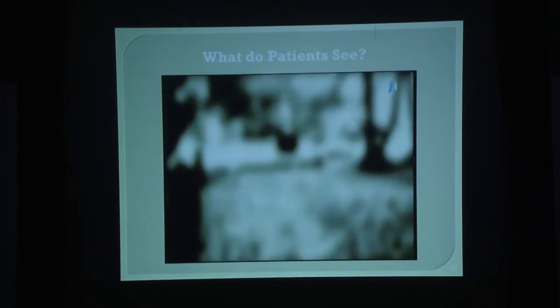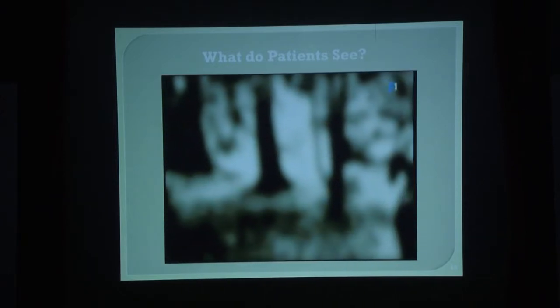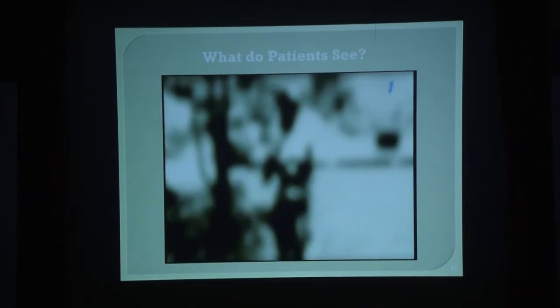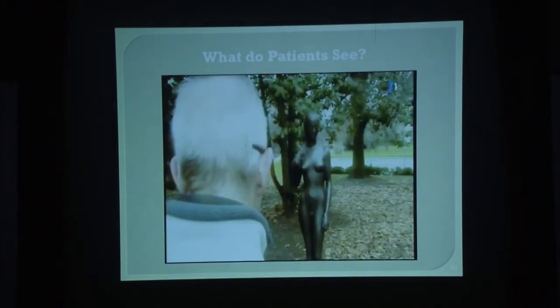There are basically different gradients of shades, different contrast sensitivity areas, and the patients have to learn how to interpret these different gradients of light. And I can tell you they can do it very well. There are some patients which after the training perform fantastically. And of course, not all of them are like this, but I think that has to do a lot with the expectation the patient has. If the patient is well screened and has the right expectation, usually they will perform very well.